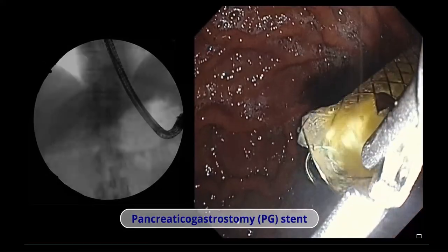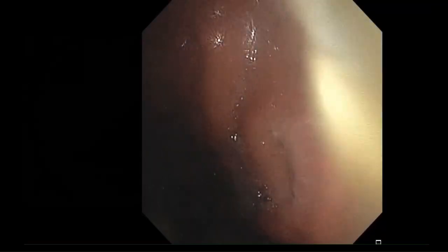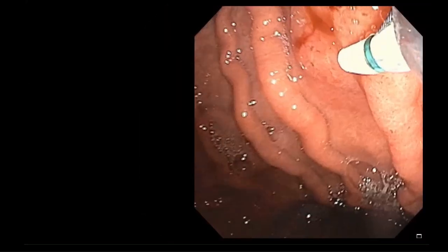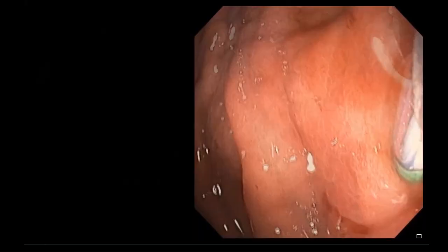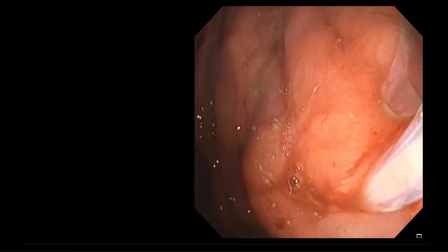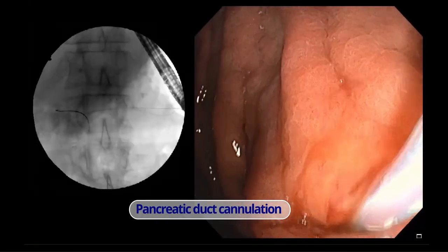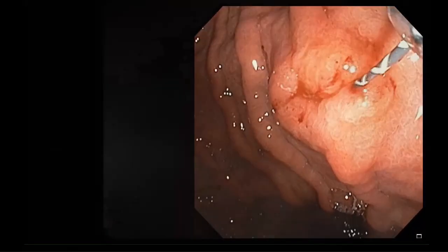The fully covered self-expanding metal stent was removed from the pancreaticogastrostomy site. A sphincterotome preloaded with a guide wire was used to cannulate the pancreaticogastrostomy site, and the guide wire was advanced into the pancreatic duct past the pancreatico-jejunal anastomosis.